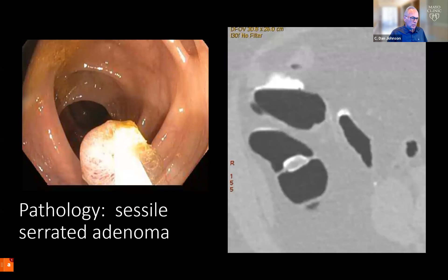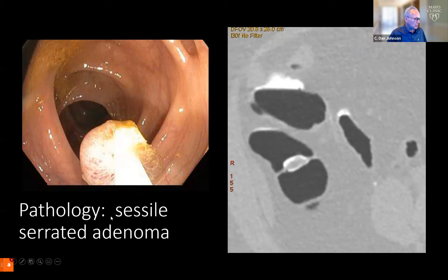The lesion was noted and colonoscopy was performed for removal. They did remove this polyp, and on pathology it was a sessile serrated adenoma.